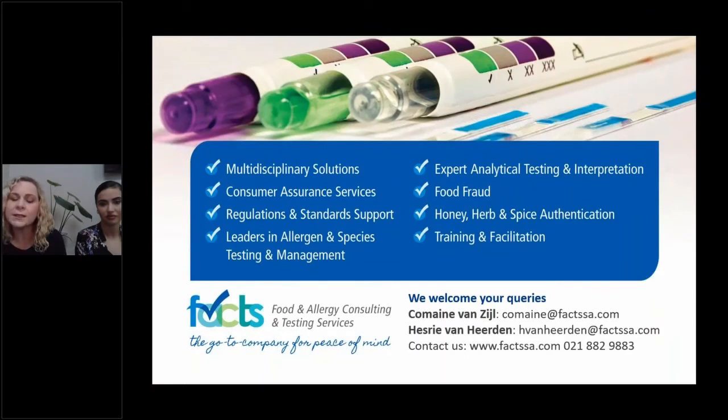So in this case, screening, but this is a moving target. Rapid kits are becoming more sophisticated literally by the day. So in future, it might be possible, but at this stage, we would recommend it for screening purposes. And I'm sure we'll see development of legislation accordingly, possibly not within South Africa as fast as we'll see that kind of process happening within the US or in the EU. So I think we need to be watching what's happening in those markets.